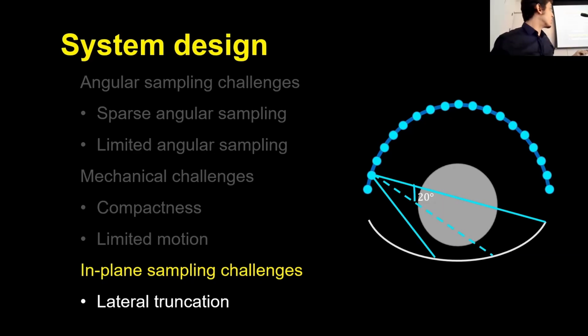With the curve detector we are going to have some rays which are perpendicular to the curvature of the detector in that position. So, for example, when we went to the total linear flat panel configuration, in those cases we saw a worsening of the images, and one of the reasons was exactly what you were talking about. So, yeah, you're right. What's the limit, do you think? How far away from the perpendicular can you go?